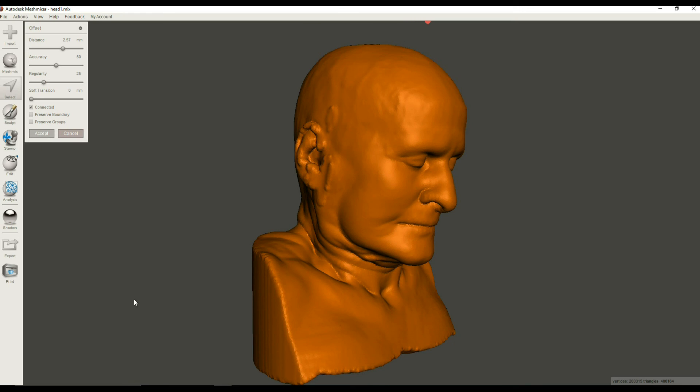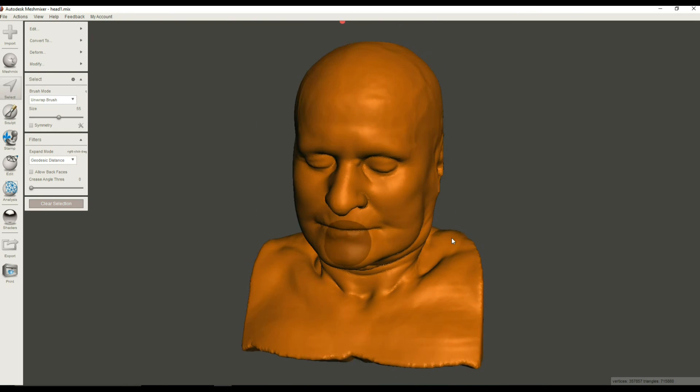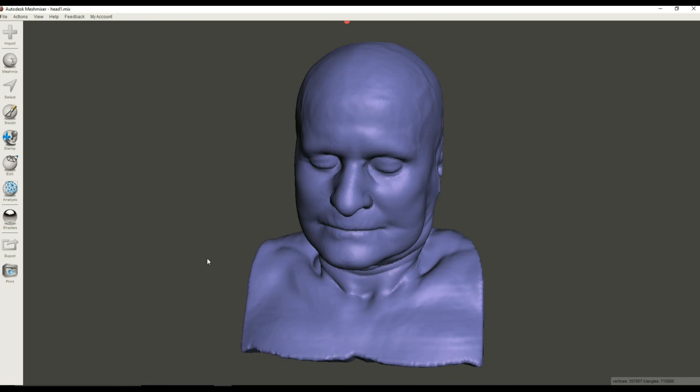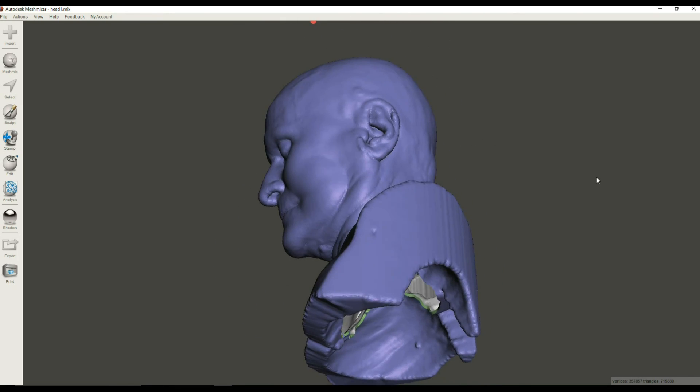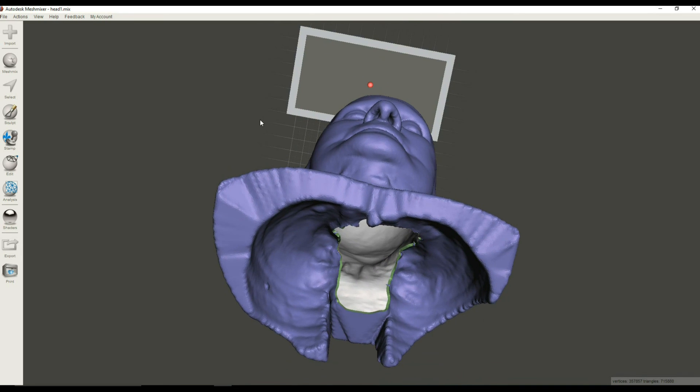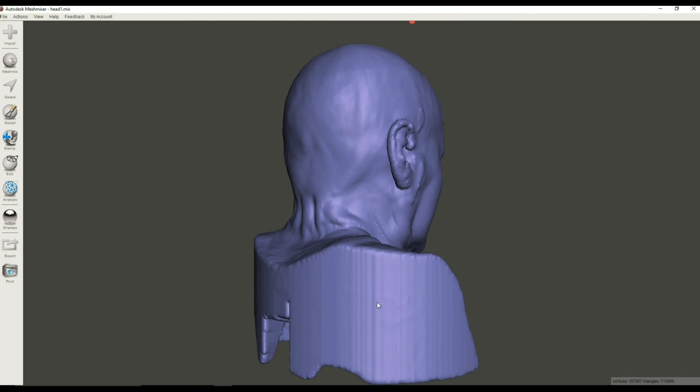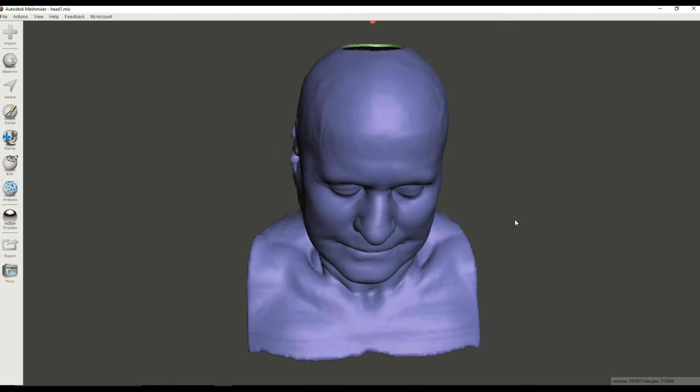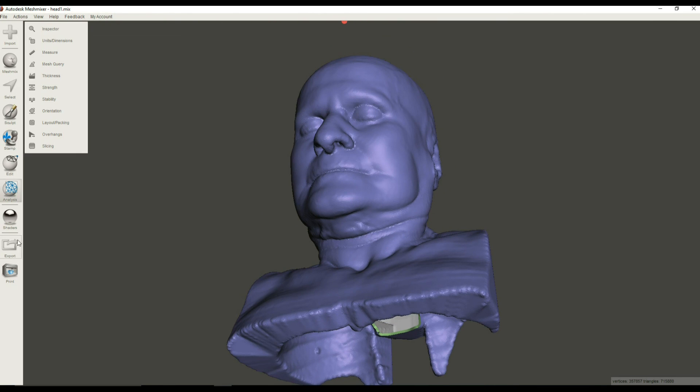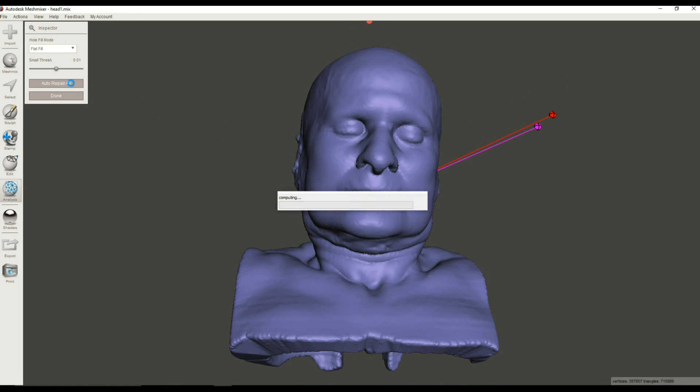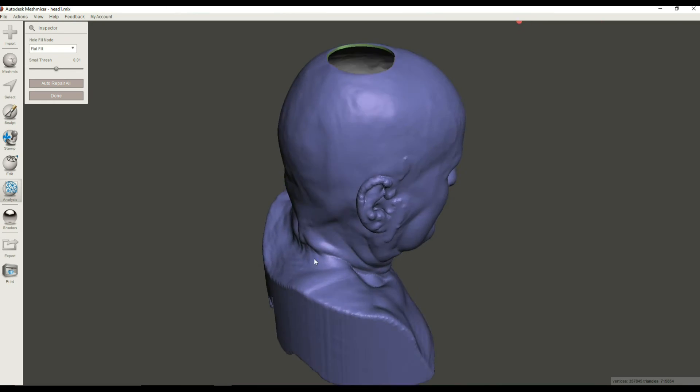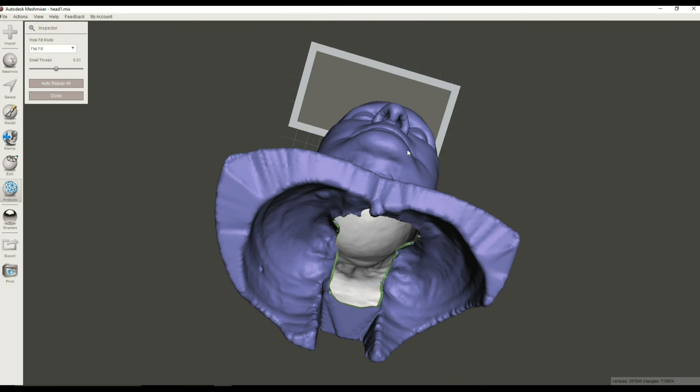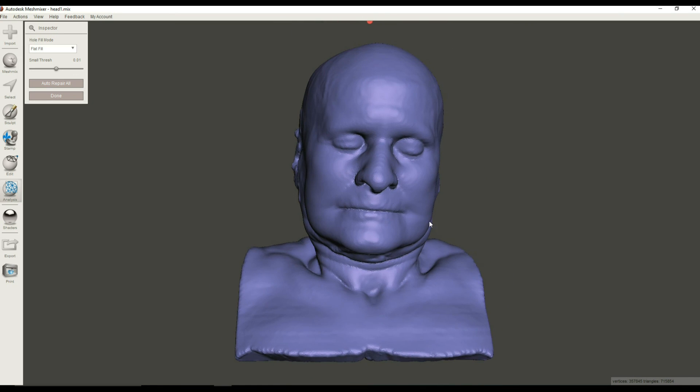And that should be about it. So that is how you use Mesh Mixer to create a hollow model. Go ahead and clear that selection. Go ahead and create a hollow model of your skin STL file. And you can see that because this is new geometry that's been added, Mesh Mixer codes it blue, but that's okay. We can go to Analysis and just make sure that it's all ready to go for 3D printing. So there's a couple small things to fix. Those are auto-repaired, and we are now ready to 3D print this as a hollow shell.